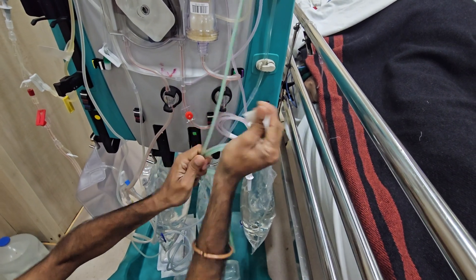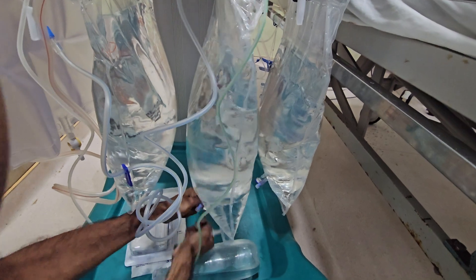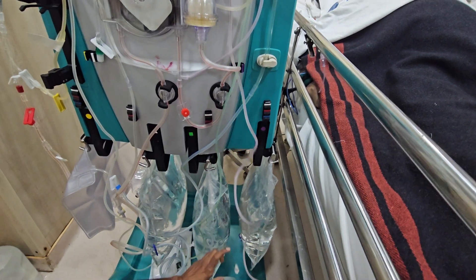Green cannula connected to the dialysate fluid. Purple to the replacement fluid.